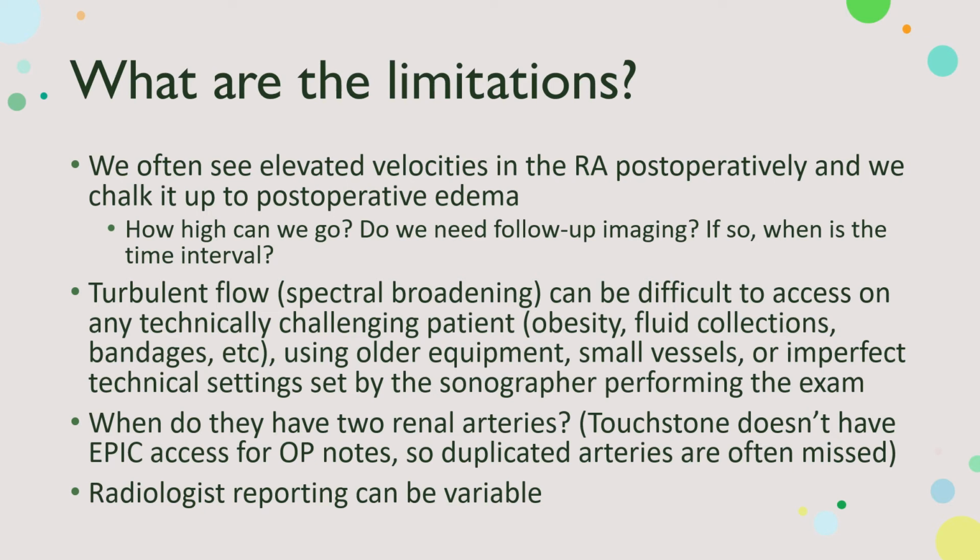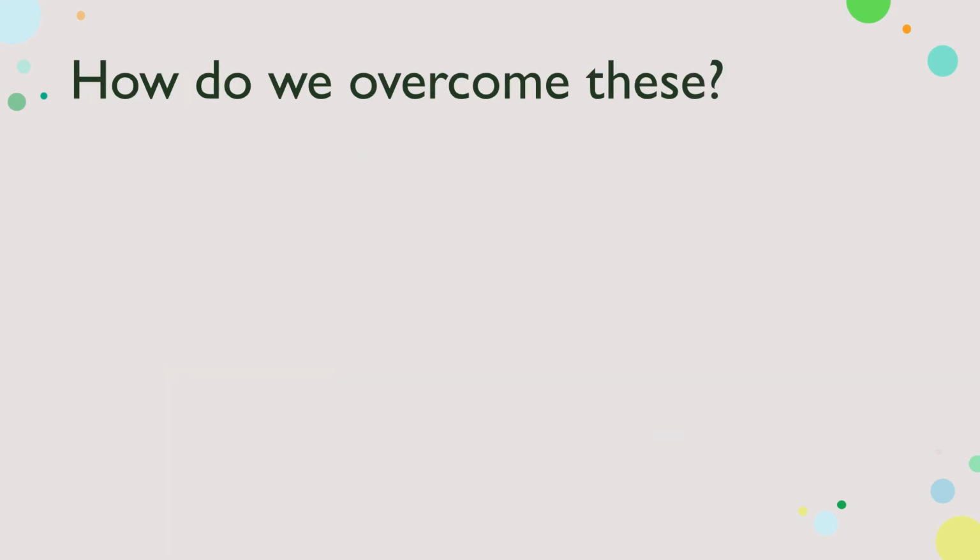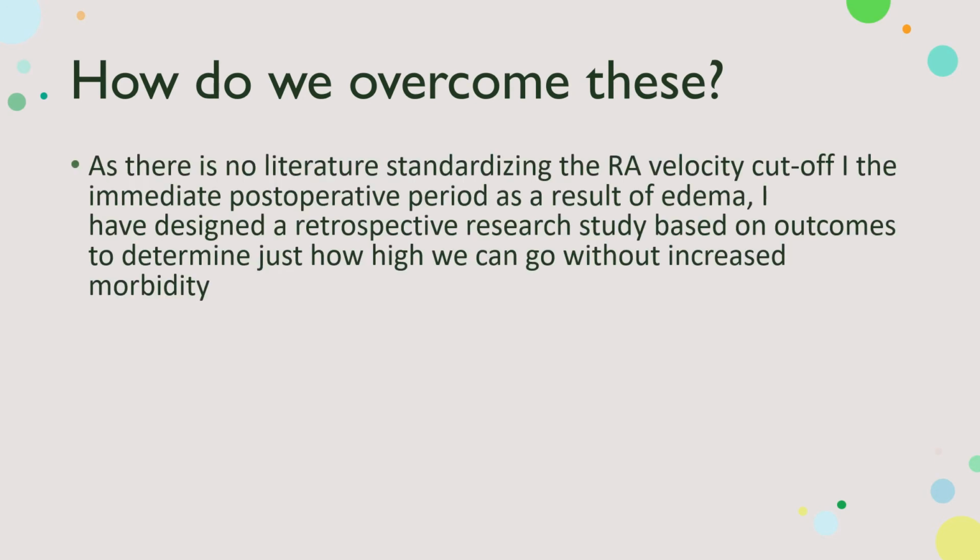So all of these things put together can make it difficult for the surgeons and the nephrologists to figure out what to do with this information. So how do we overcome these? Don't worry, we're going to overcome them.